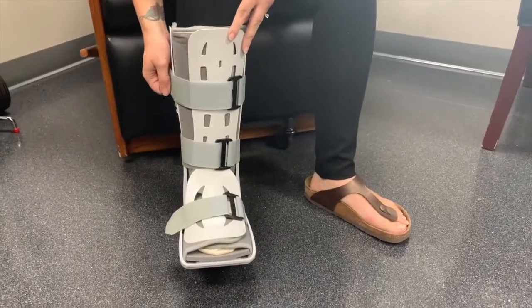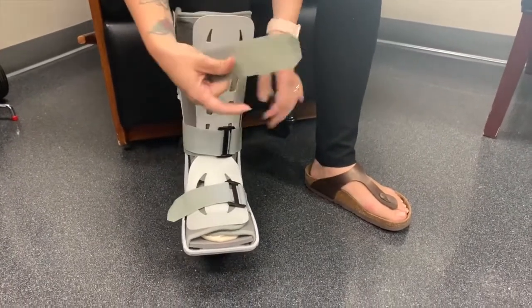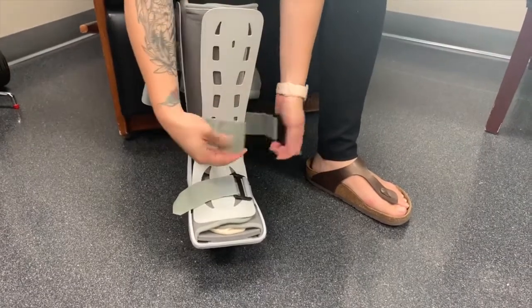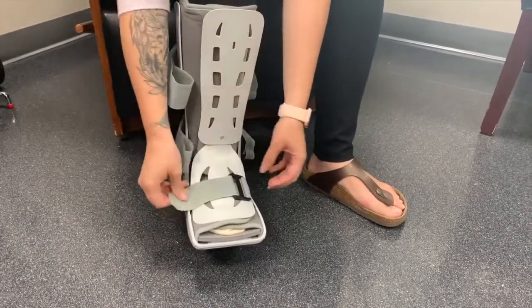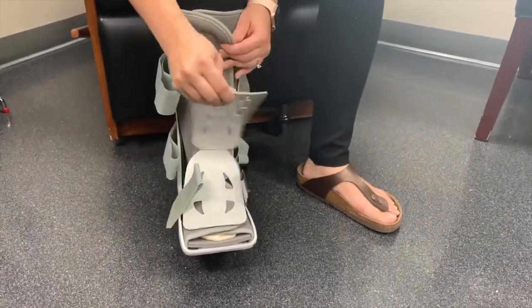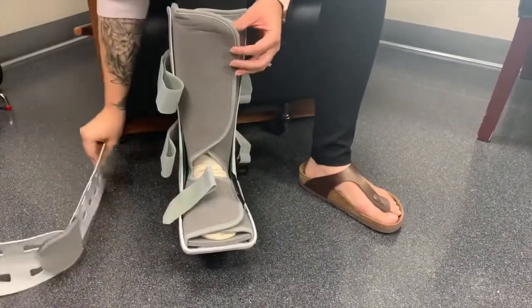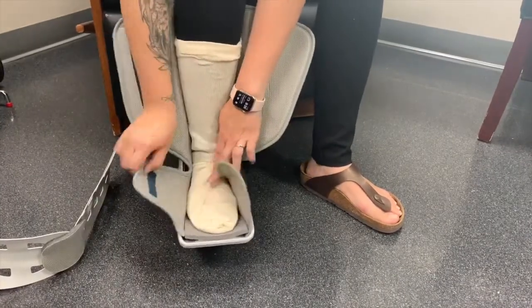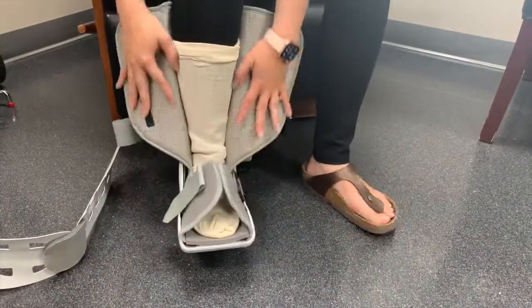To take off the boot, strap each of these three straps. Take off the top cover and pull off these soft covers.